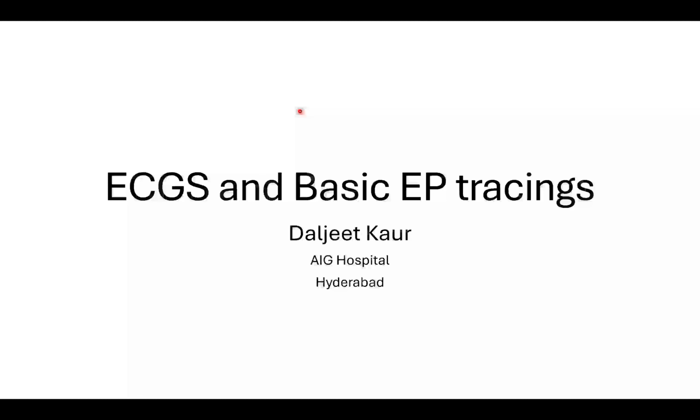So, my responsibility is to talk about ECGs and basics of EP tracings, and understand that this is for our DM/DNB cardiology students. So I'll be talking very basics about the relation of the ECGs with the basics of EP tracings, or in the electrophysiology lab, what are the basic recordings we do, and to some extent how do we differentiate these different kinds of tachycardias.